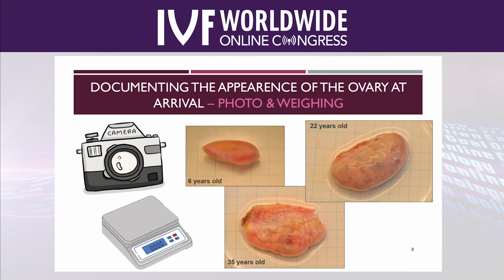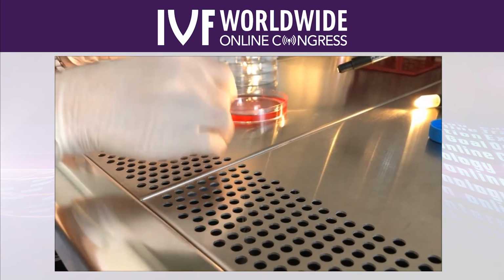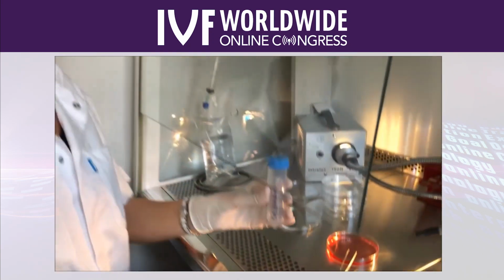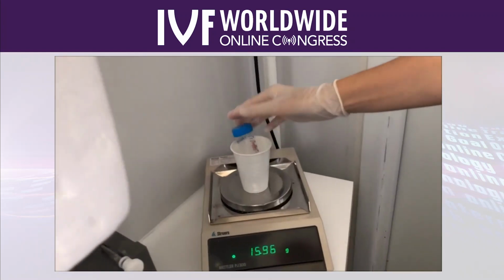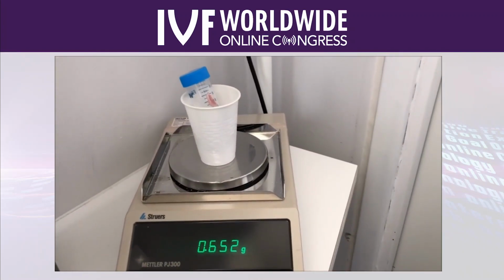From the beginning, we start documenting the overall appearance of the ovary. We take pictures, and here you can see 3 examples, and then we also weigh the ovary. Here we have a small ovary from a little girl that has arrived, and we simply take the ovary and weigh it. As you can see, it's a very small ovary. This is an ovary from a 3-year-old girl.